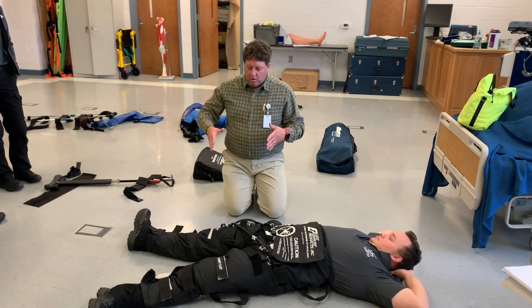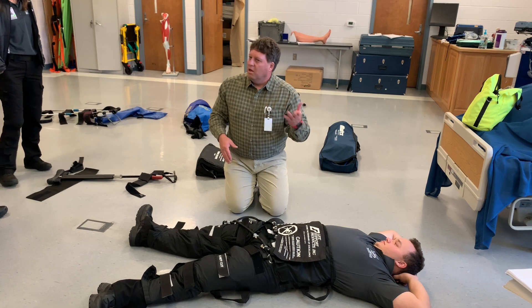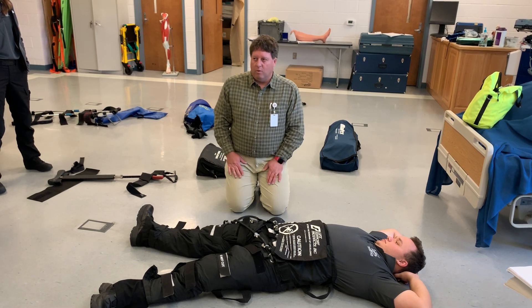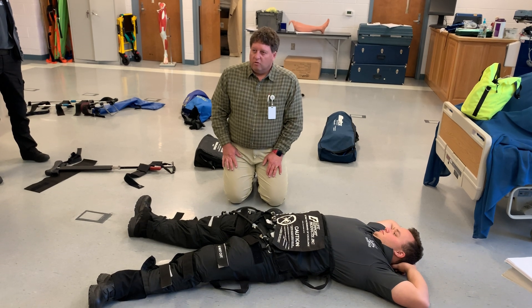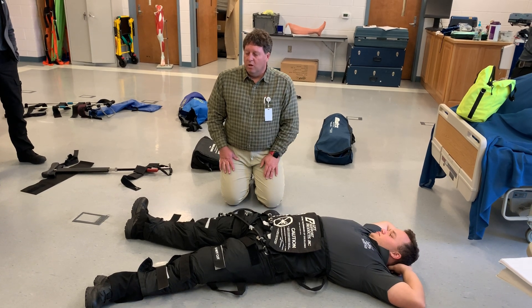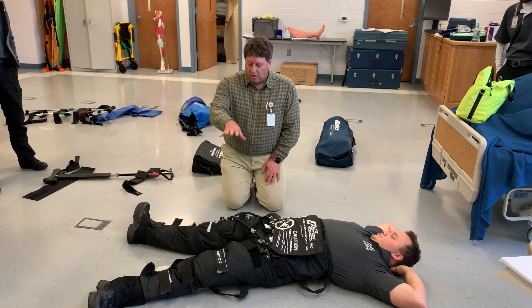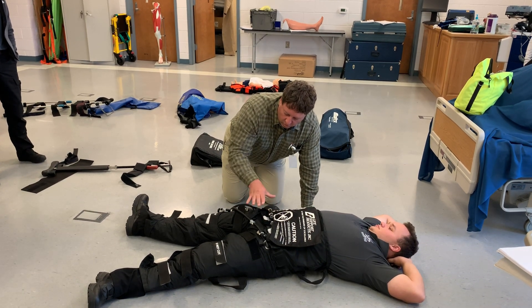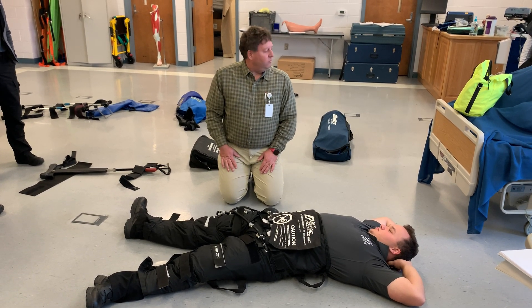With MAST pants used for shock, we inflate one leg, then reassess vital signs to see if blood pressure has come up. If it hasn't, we inflate the second leg and reassess again. If it still hasn't come up, we do the abdomen. One concern is that pushing all this fluid up into the chest may cause difficulty breathing — you need to listen to the lungs because you could put the patient into heart failure with pulmonary edema. If you hear that, stop. One leg, then the other leg, then the abdomen. When done, make sure the valve is perpendicular so it's closed, then load the patient on a backboard and transport. You can see why this takes time and why it's out of favor.